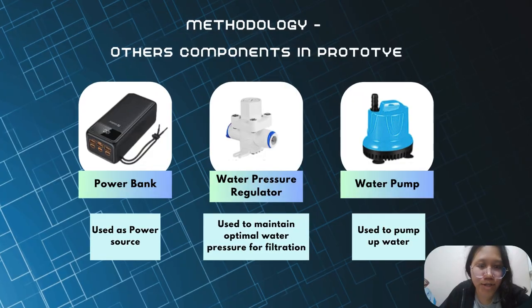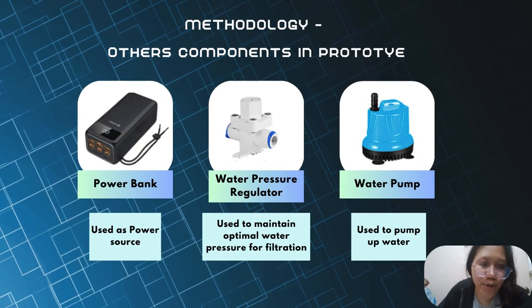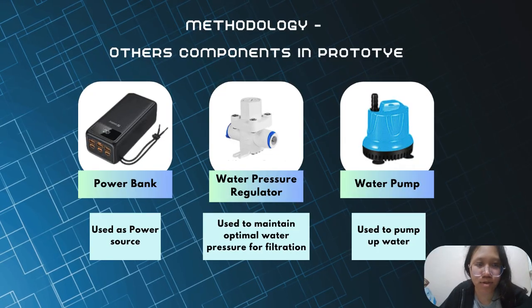We're using a pressure regulator to maintain optimal water pressure for filtration. And lastly, we're using a water pump to pump up the water.